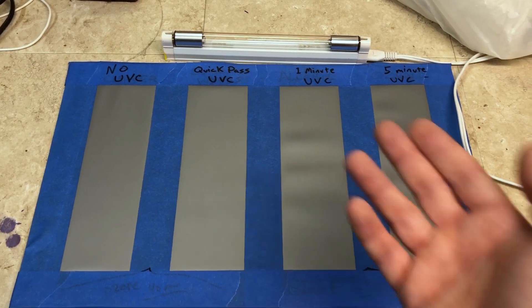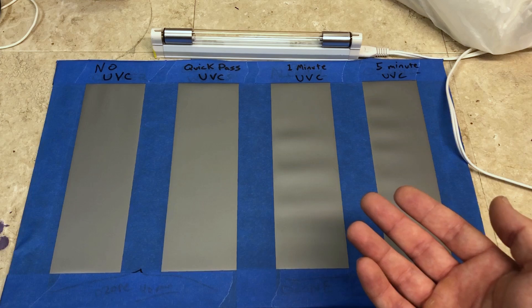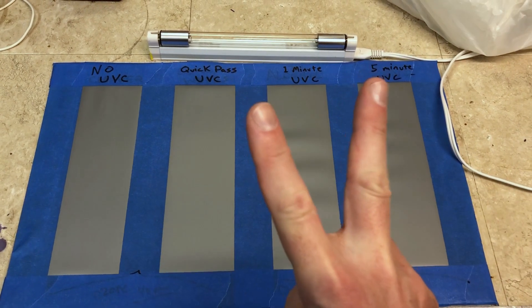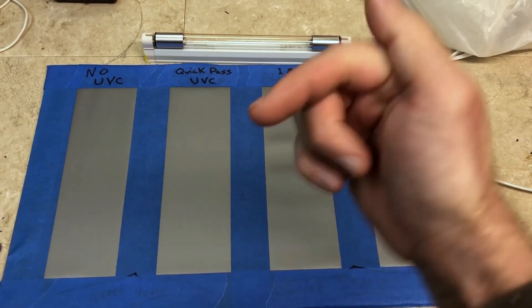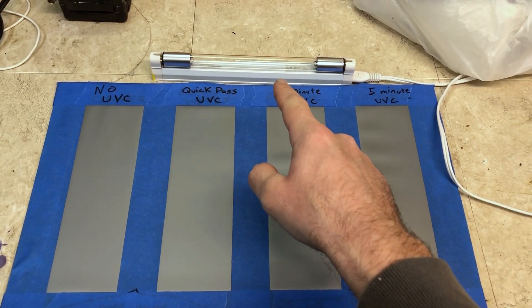Today in this video we're going to be testing out UVC light and comparing it to ozone to see which one is more effective as a disinfectant. We're not going to be doing anything with ozone in this particular video — I've already done two videos on that, and they will be linked at the end of the video or in the video description.